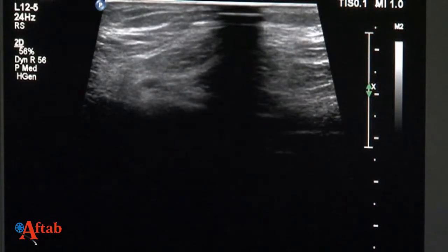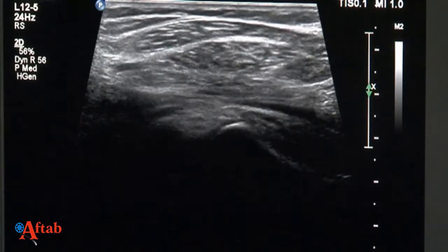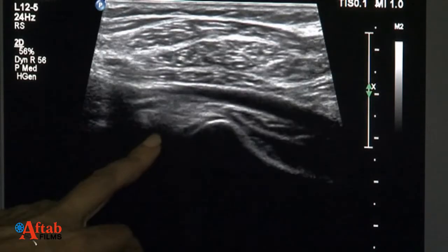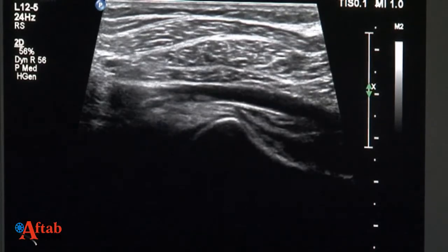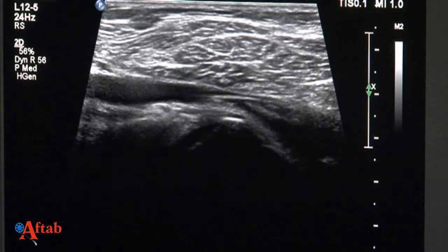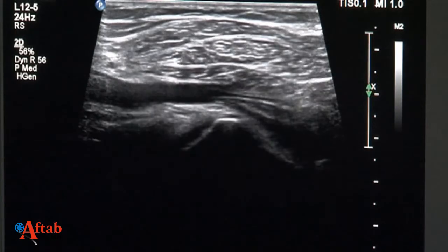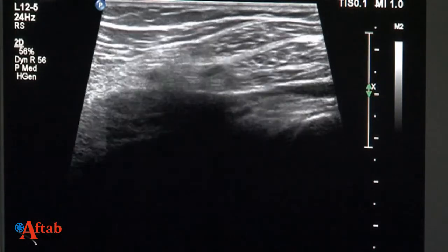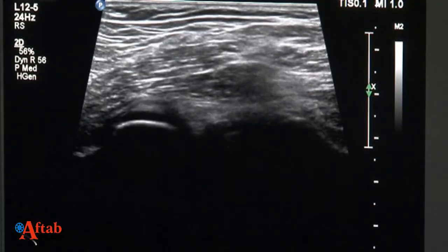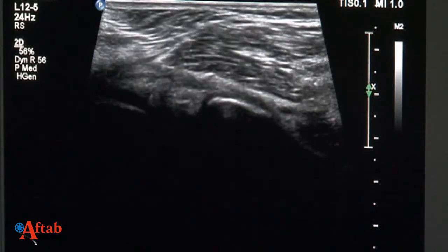Posteriorly, if I go and assess, I have good distinction of the interfacial planes. That is the lateral cruciate, lateral meniscus. Why do I keep saying cruciate? I'm in love with cruciate, it seems. Anyhow, so that is the posterior horn of the lateral meniscus, and you can see very clearly the cartilage of the femoral condyle. Again, the posterior horn of the meniscus.